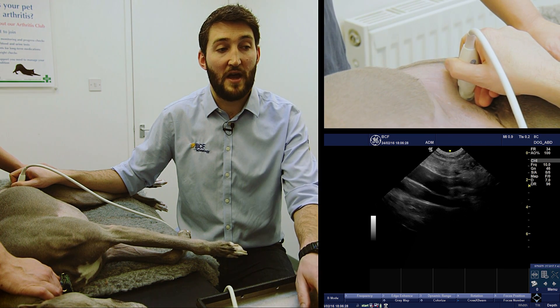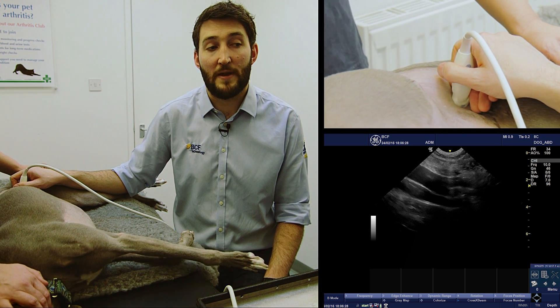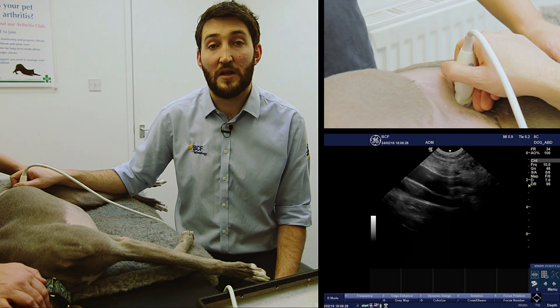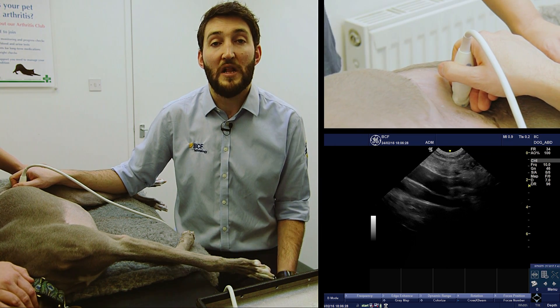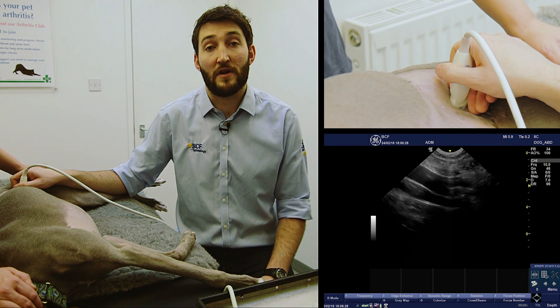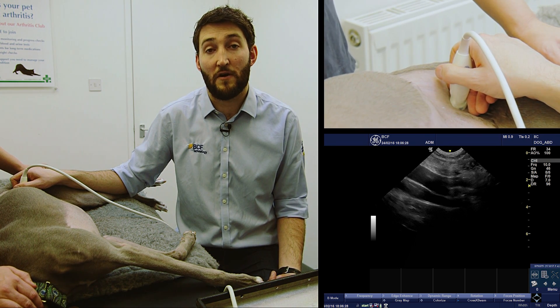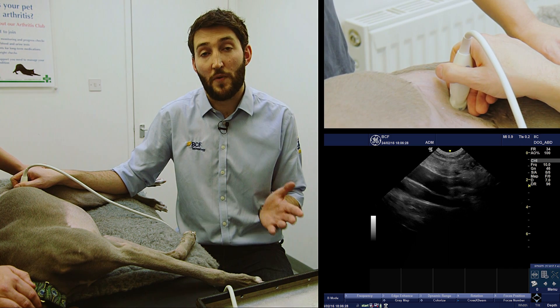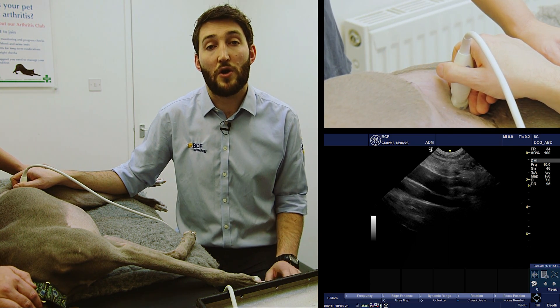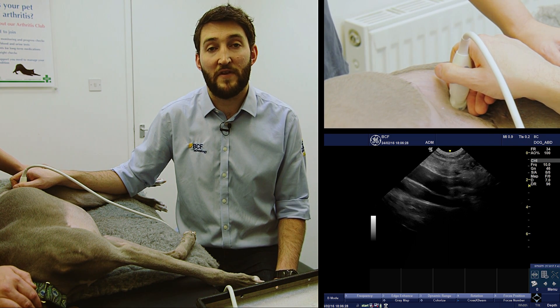If I pause here, we're able to see at least part of that lymph node on the screen. Because this is the top of the screen, this is the left medial iliac lymph node. If we want to scan the right medial iliac lymph node, we can either turn the dog over and scan from the other side — scanning from the right with the dog in left lateral recumbency — or we can simply look on this image between the aorta and the vena cava.